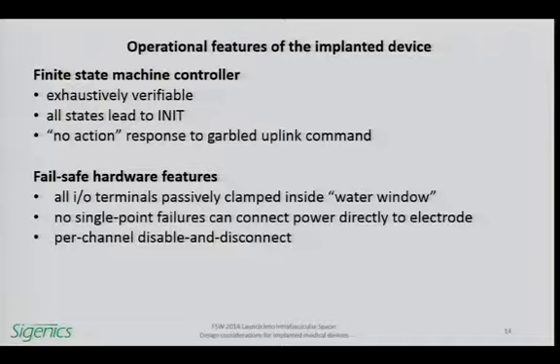Yeah, that's actually part of the safety and FDA standard set, which includes what's called validation and verification. We need to verify that the device we design actually meets its specified performance, and then validate it in some kind of realistic application. In the case of this device, that is a dog brain. There's actually a way to induce epileptic seizure centers. It's not something that's done to people typically, but one can do it to dogs and put the device on the dog's brain and verify that it actually does its intended function.